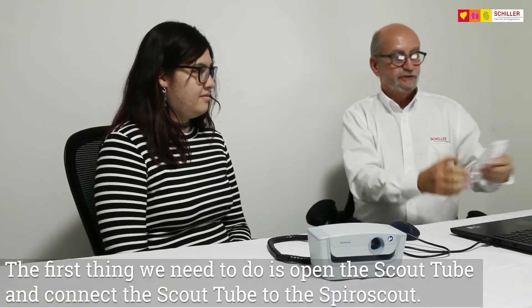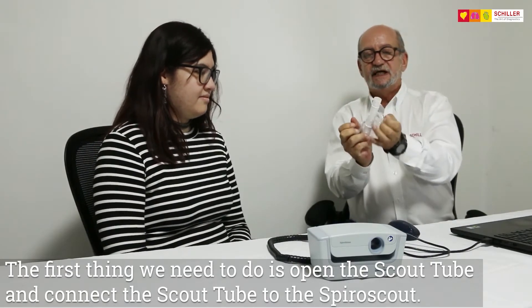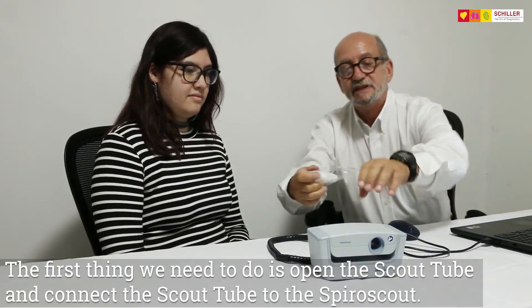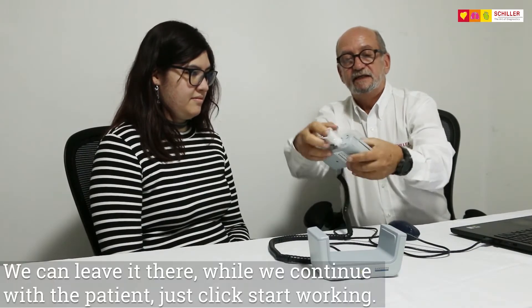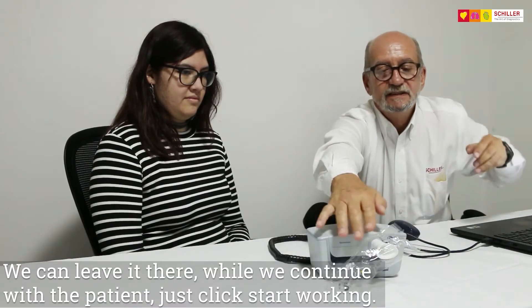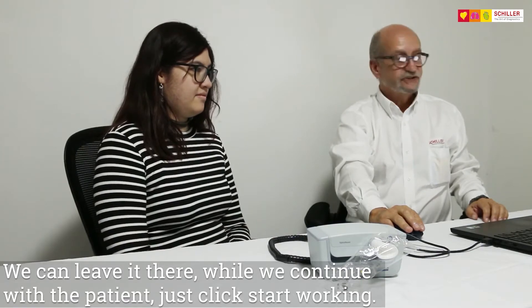The first thing we need to do is open the scout tube and connect the scout tube to the SpiroScout, and we can leave it there while we continue with the patient data. Just click on Start Working.